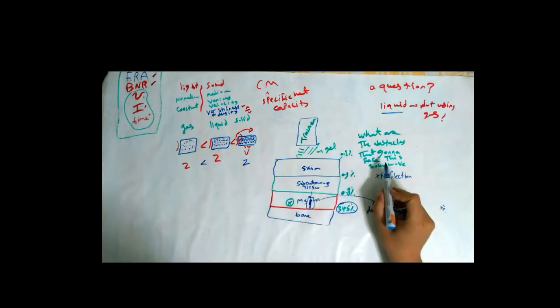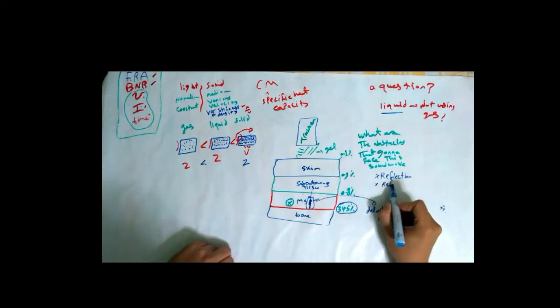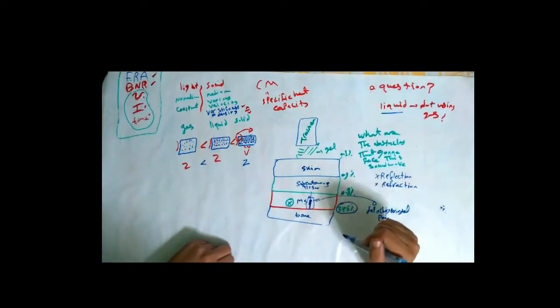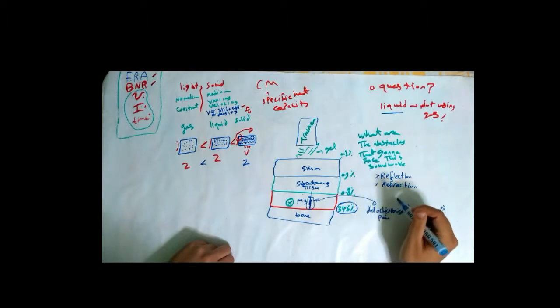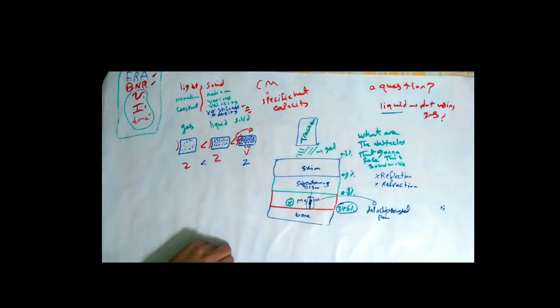Now, after we know that the first obstacle that sound waves will face to reach the lesion is reflection, the second problem is going to be refraction. Refraction also occurs due to differences between densities. When sound waves propagate between different densities, some of it will be deflected. To minimize this, when we're doing ultrasound therapy, the transducer head must be perpendicular to the treating area.